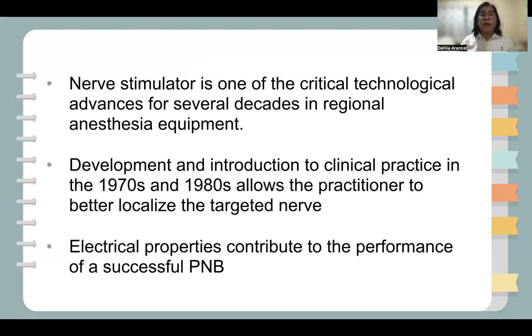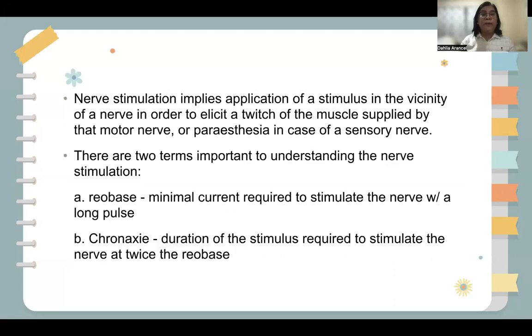Nerve stimulator is one of the critical technological advances for several decades in regional anesthesia equipment. Development and introduction to clinical practice in the 1970s and 1980s allows the practitioner to better localize the targeted nerve. Electrical properties contribute to the performance of a successful peripheral nerve block.